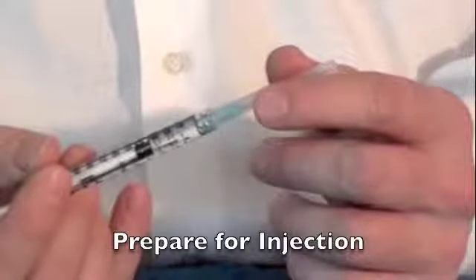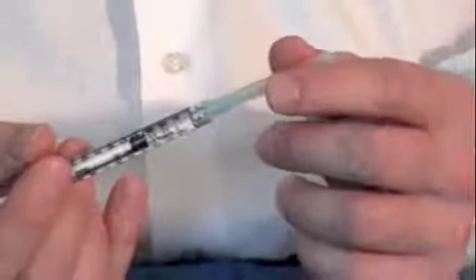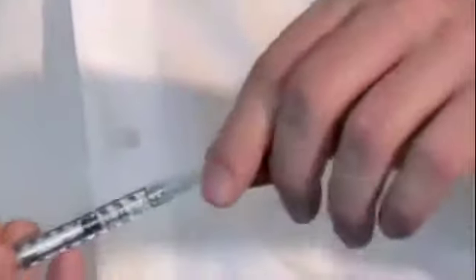We are now ready for an injection. I'd like to review a very important step prior to injection, no matter what site you're using. Remove the cap of the needle. Testosterone is very oily and provides a good lubricant as the needle enters the skin.